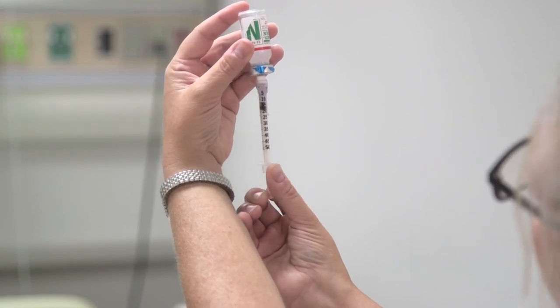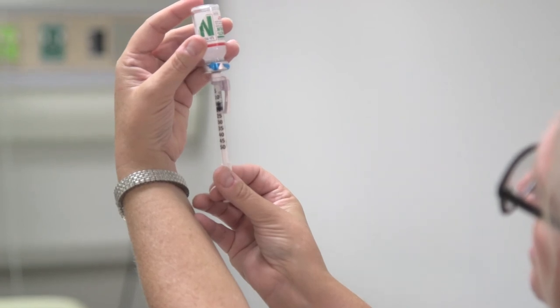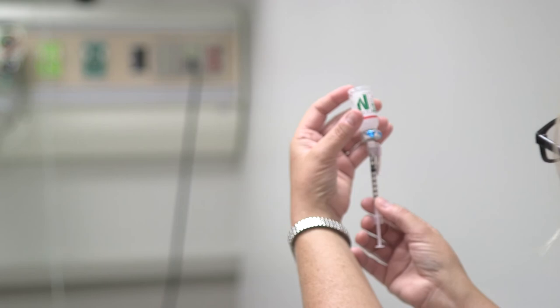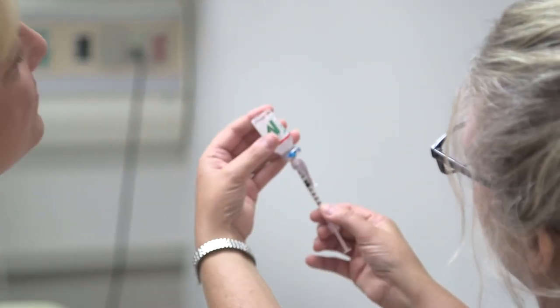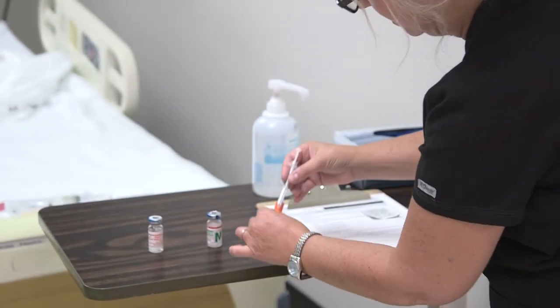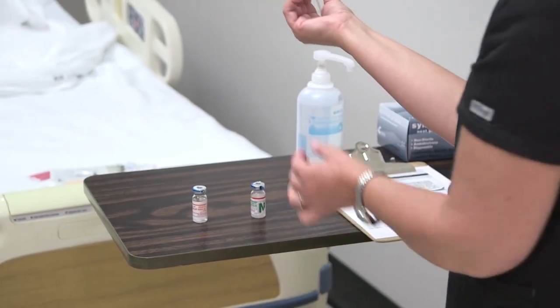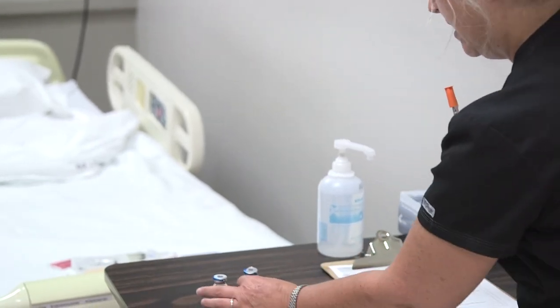I need to draw down so that the top line ends on 15 units total. My assistant RN Kim is going to verify that I am at 15 units, and I have NPH insulin here for Sylvia Vasquez — we both look at the MAR. Now I can recap the syringe, and I'm ready to inject the insulin to my patient after I do my final checks.